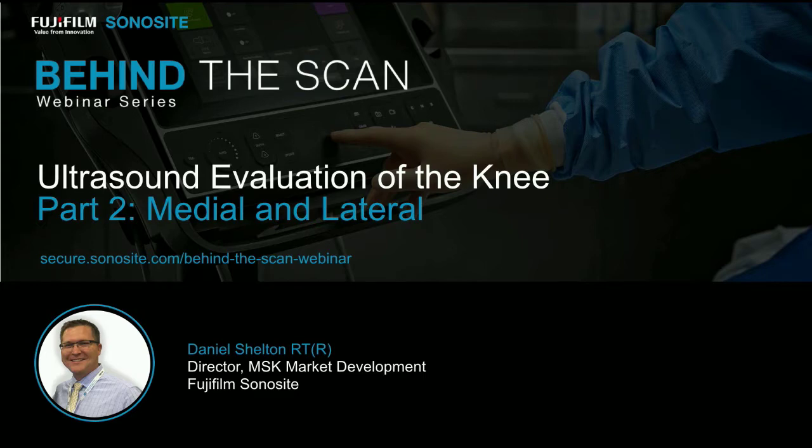Thanks, Chris, and good afternoon, everybody. Excited to be here. This is one of my favorite topics to discuss because I think there are a lot of challenges when evaluating the medial and lateral knee. As easy as the anterior knee was, this one is just a bit different. So we're going to take a different approach to how we look at the anatomy today, and I'm very excited to show you the pearls and scanning tips for the medial and lateral knee, especially those collateral ligaments, and the PES complex, which I think is pretty mysterious for a lot of people when they're learning this. Hopefully we're catching you early in your learning curve, and you can take some of these tips straight to your clinical practice.